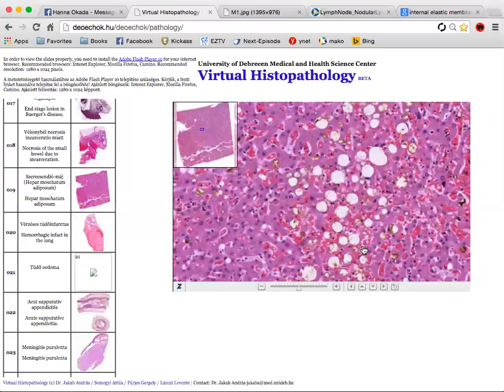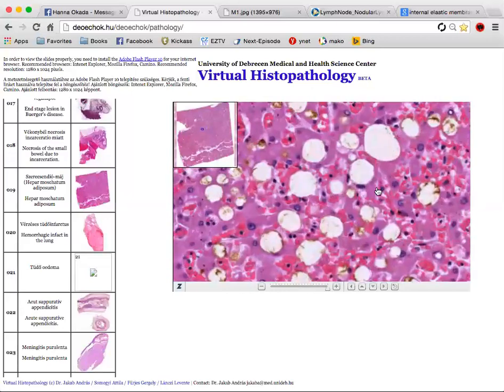You said adipocytes. Don't say that in the exam. These are all hepatocytes. Yeah, hepatocytes. Sorry. If you think that you're going to mix them up, say liver cells. It's better to say hepatocyte once and then say liver cells.